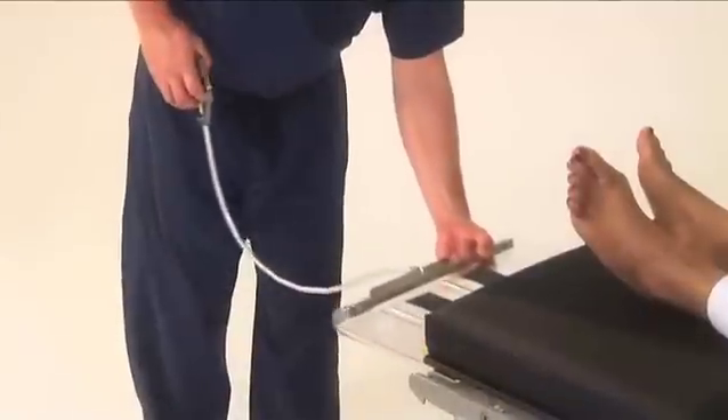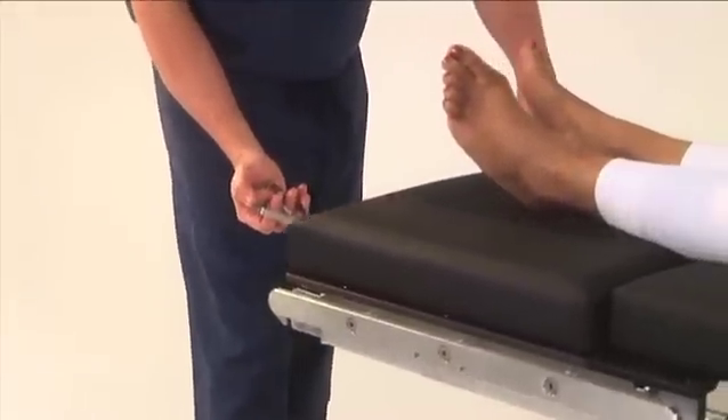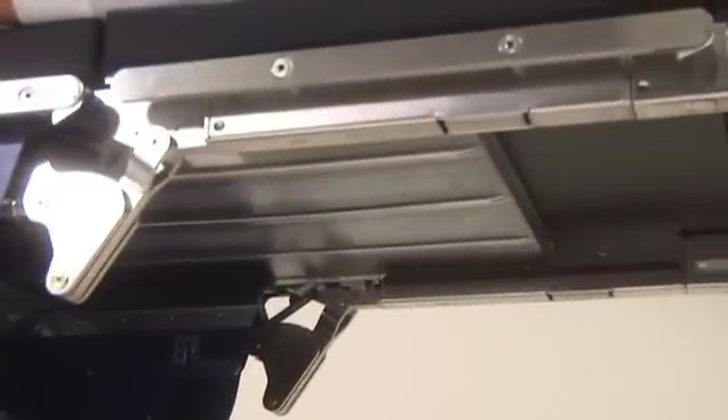Slide the tray onto the integrated track. By pulling back on the attachment cable knob, the cable becomes taut and allows the caregiver to slide the cassette the full length of the table.